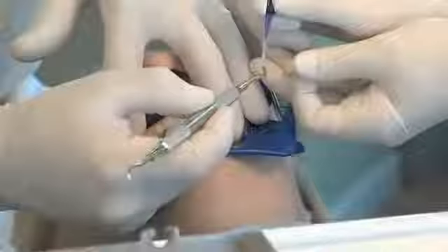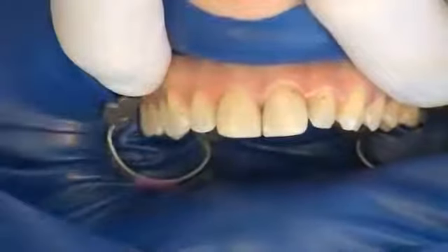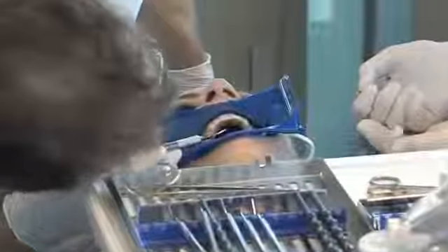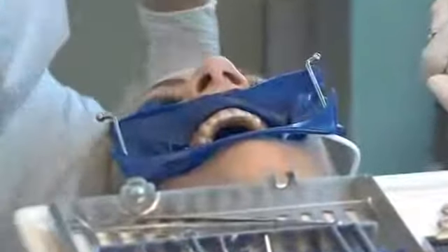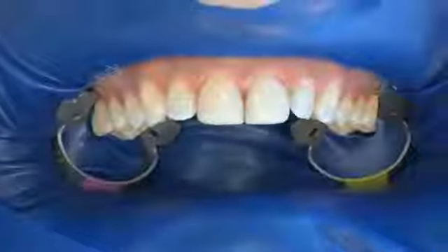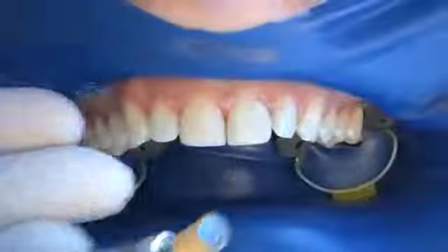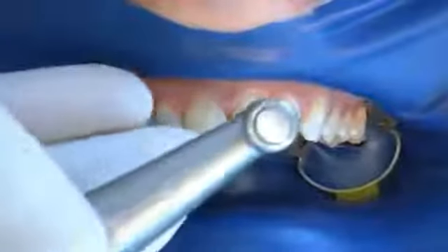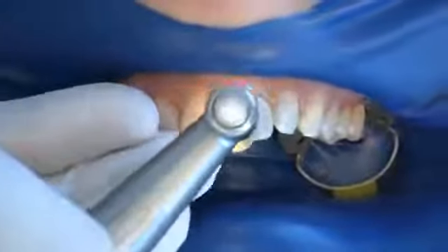The facial tab is then attached to the gingiva; the rubber dam is also fixed on the palatal side. As can be seen, the operating site is dry and clearly visible. The teeth are cleaned with toothpaste and polished with a rubber cup polishing tool to ensure optimum preparation.